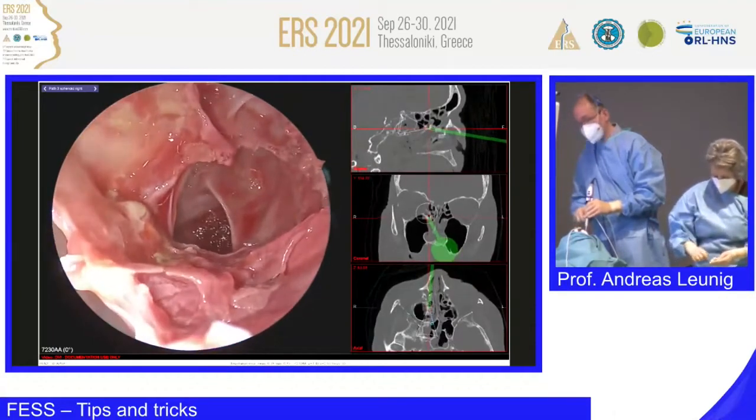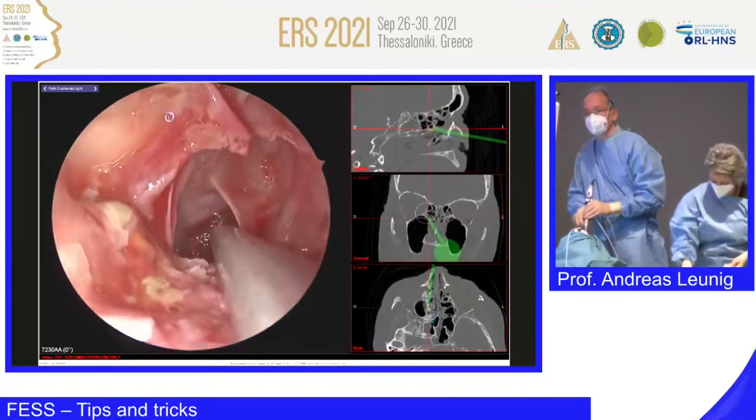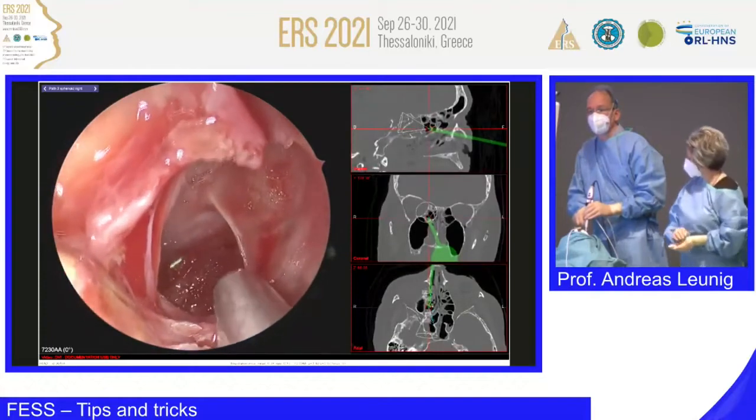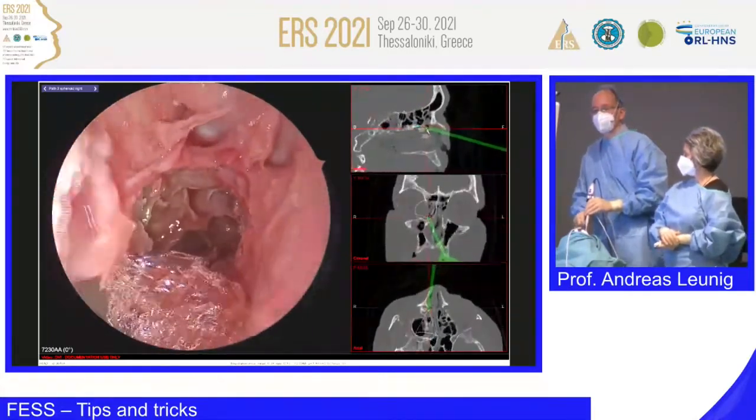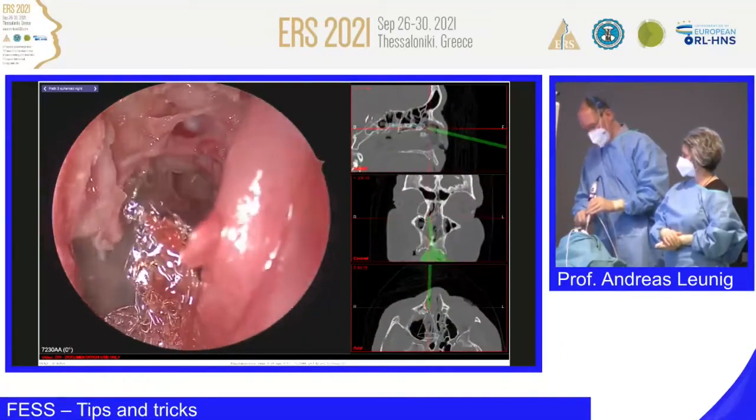You see there's some ice in this sphenoid sinus. Oopsala. Okay, so this is a foreign body, isn't it?